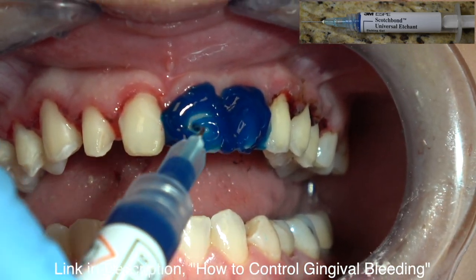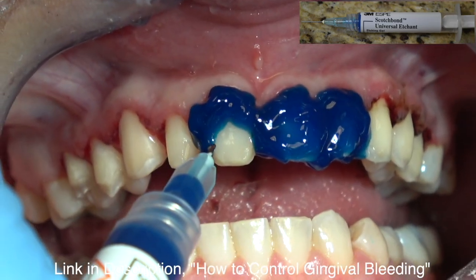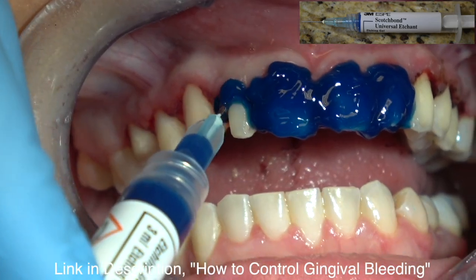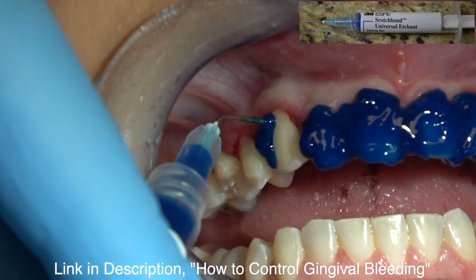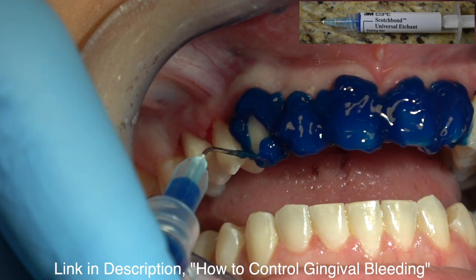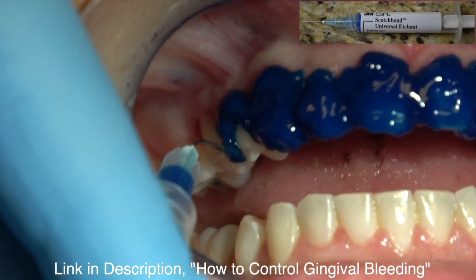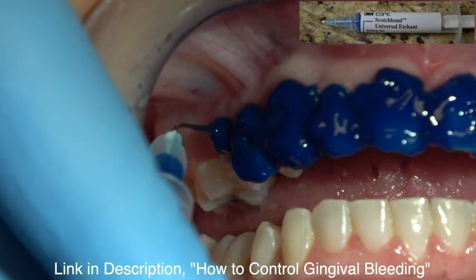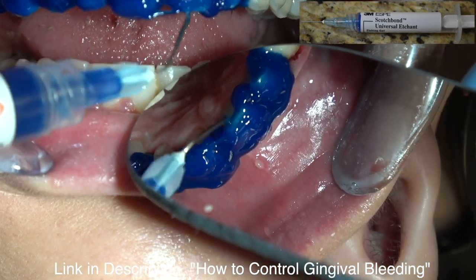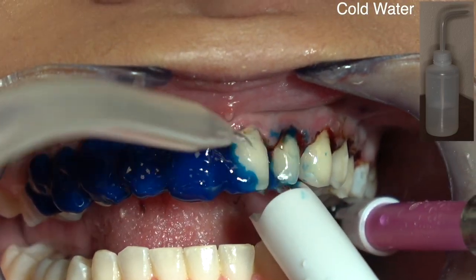Just have a little bit of oozing, but you don't want any blood to get under the veneer. If any blood gets under the veneer it'll make a dark spot and you'll have to redo that veneer, so you want to be sure there's no blood under the veneer. Having some scab bleeding is okay. This is ice cold water again because I don't want to stir up the bleeding. This is a good case to talk about because I don't know that I've ever had a case that had this much bleeding.